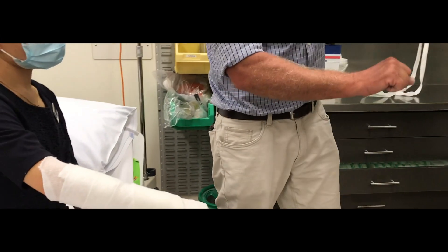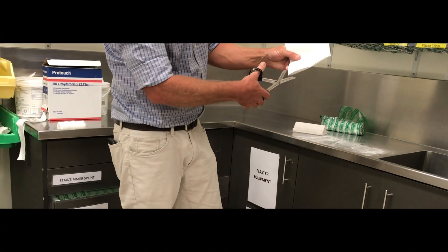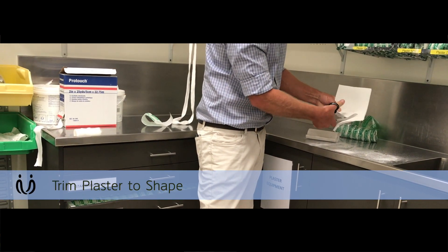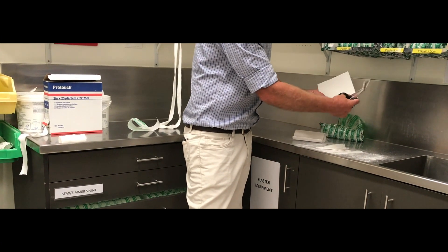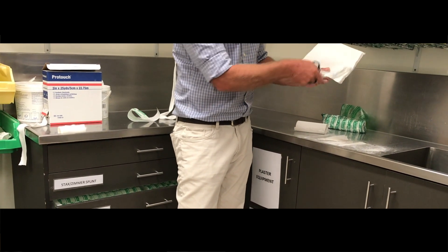Your knuckles in that position slope back a bit, so with your plaster we're going to cut a little bit of diagonal off there. That allows for your knuckles where it's going to slope back. You'll see lots of different ways of cutting this plaster for a Colles' fracture, but as long as you learn one way. All equally effective.